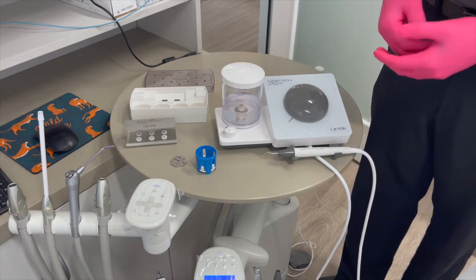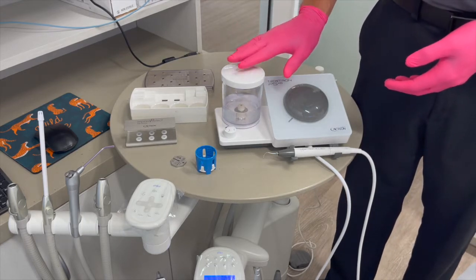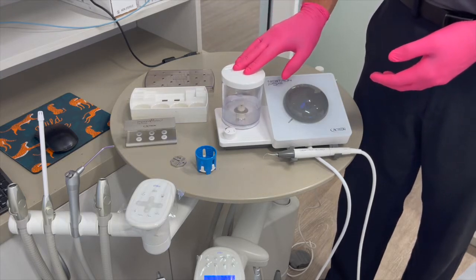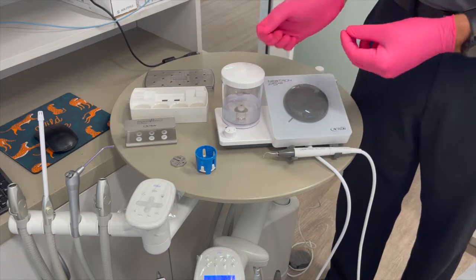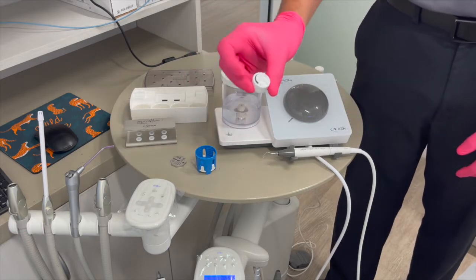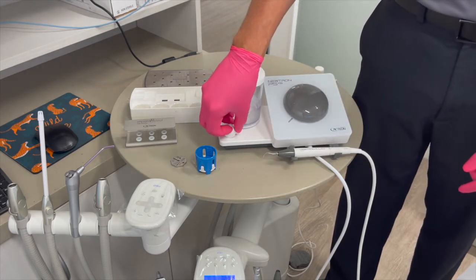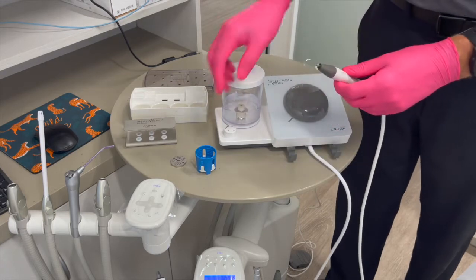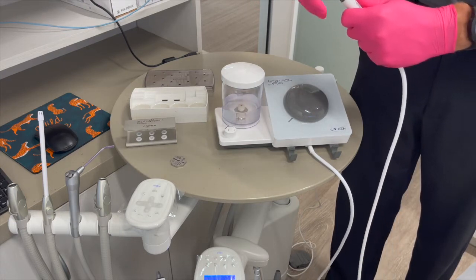First, let's talk about the irrigation tank — this is applicable only to the T5XS or any unit that has an irrigation tank. If you're using any medicaments in here, you'll want to remove the tank, dump out the medicaments, and put fresh water in. Move this knob to the position with the arrow, and spin it accordingly. Once that's done, go ahead and take the tip off — keep in mind this tip has just been used, so treat it accordingly.